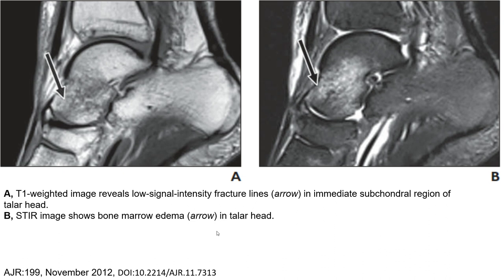The T1-weighted image revealed low signal intensity in Image A, representing the fracture line as indicated by the arrow, in the immediate subchondral region of the talar head. Image B, the STIR image, showed bone marrow edema in the talar head as indicated by the arrow.